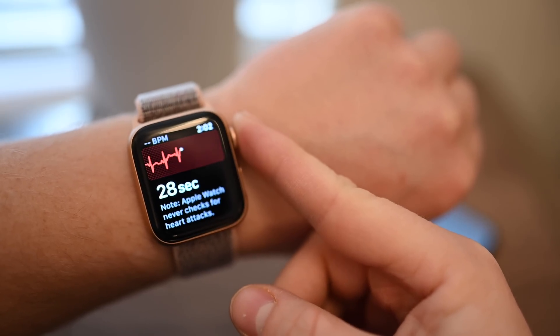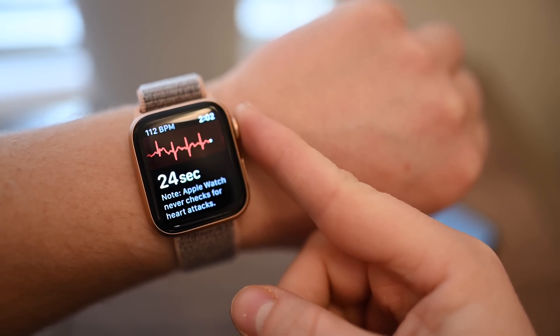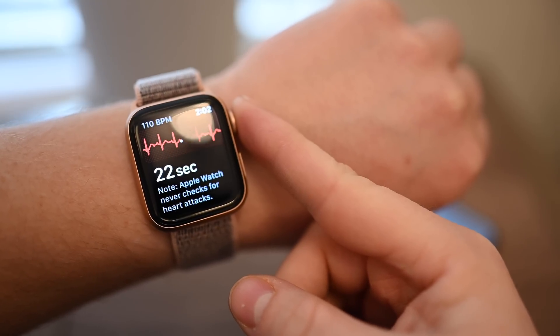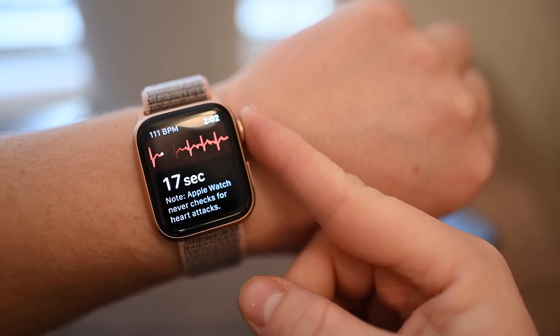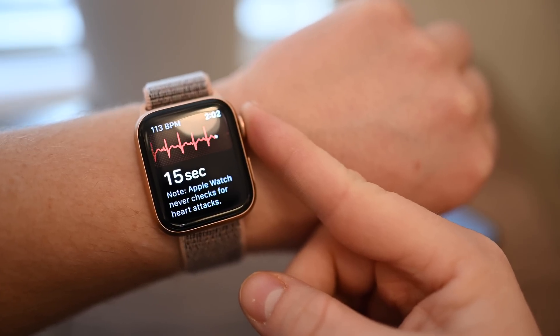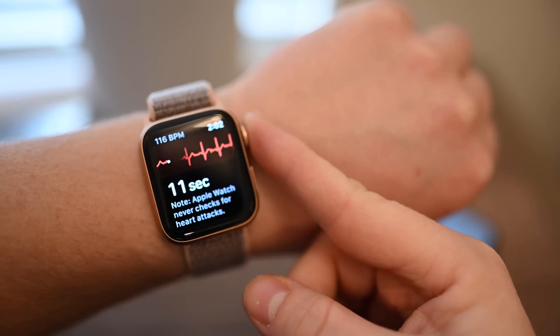There is no start button. Simply place your finger on the digital crown and let the 30 seconds count down. You'll see a real-time waveform going across the screen and your heart rate in the upper left-hand corner. And yes, when you run around before filming a video, you end up with an elevated heart rate that a lot of people will point out in the comments.